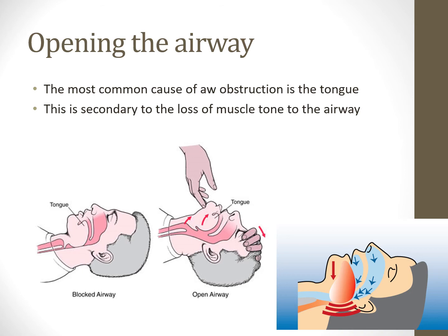So that's one of the key components, and that's one of the ways I knew someone was a good advanced practitioner or an RT: instead of just grabbing the intubation tools and going for it, they would do what they could to stabilize the airway if the patient had spontaneous breathing, and allow us to get the tools we need. This will allow them to ventilate and oxygenate well before we have to intubate them. So if you can stabilize the airway, keep it patent while the patient is breathing on their own, and optimize it, then we're going to do that.